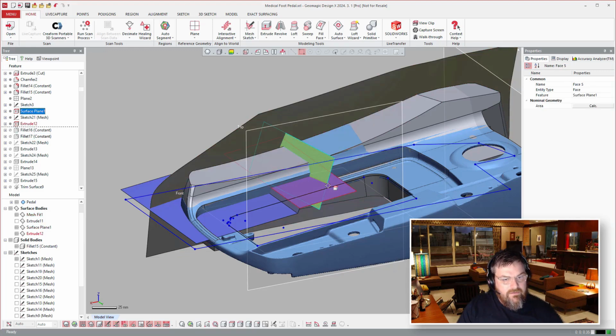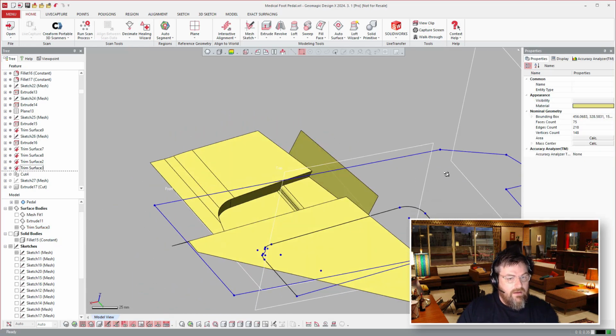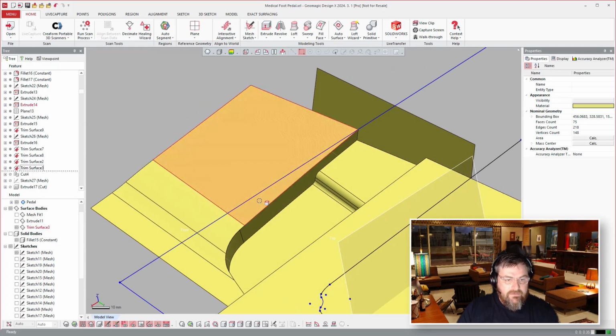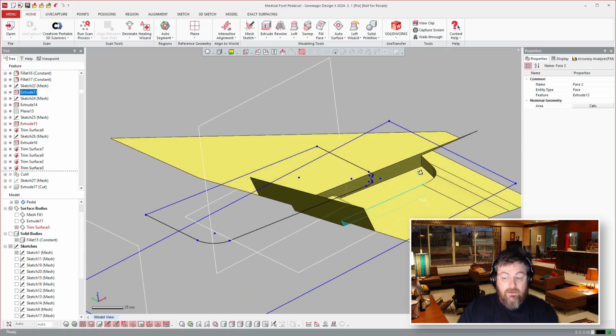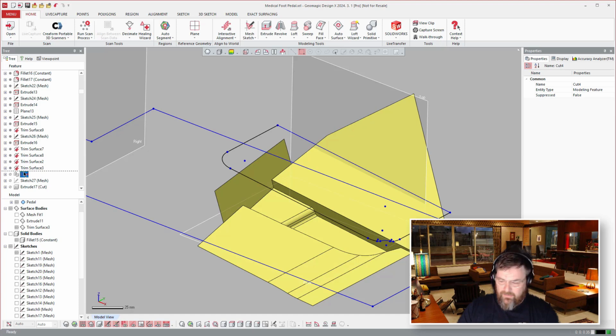So we're going to take these guys and trim them all after we create some fillets and surfaces, and then we'll just jump to the trim here. So now we'll go ahead and turn that back on. So you see that we created that tool where we trimmed all of those pieces together in different stages. Sometimes you trim this one, this one to that one, and then these 2 to that one, and you can do them in different stages. Sometimes you can get away with consolidating them down and doing less trims. Other times, it can be difficult to keep track of all of them at once, so it might be easier just to do them in stages.